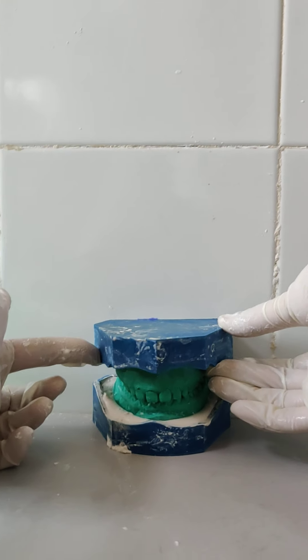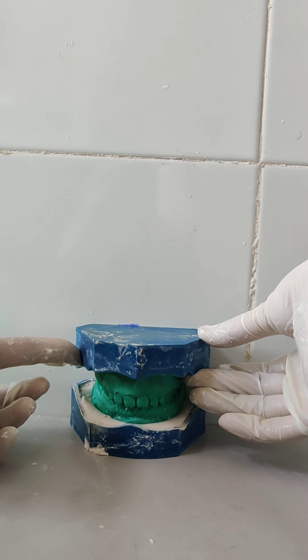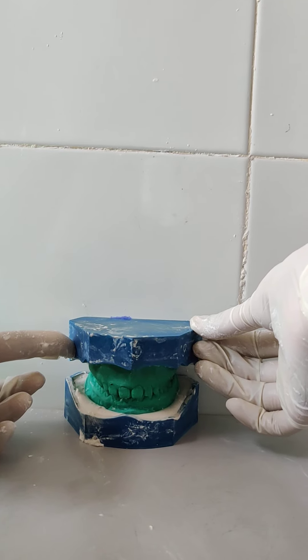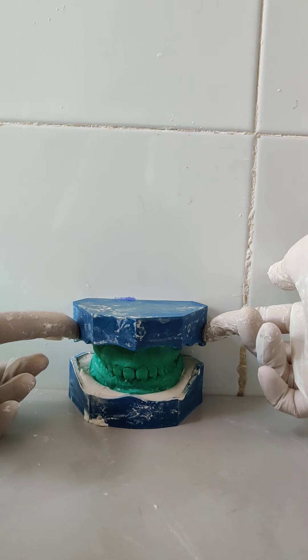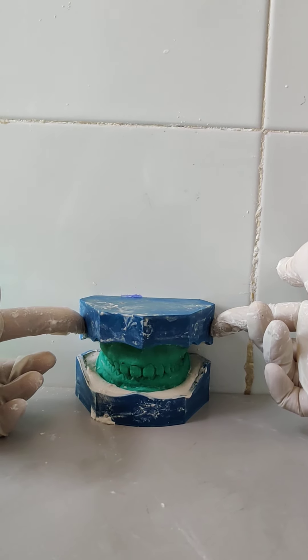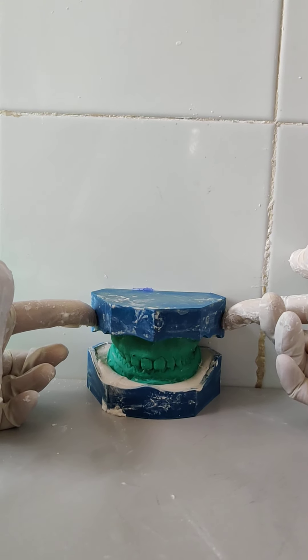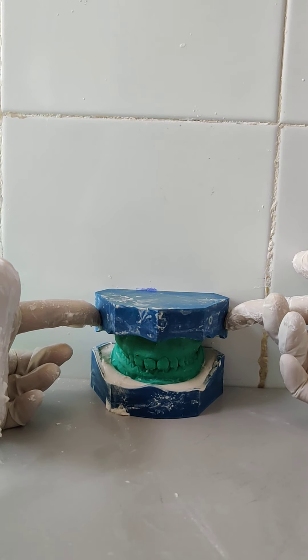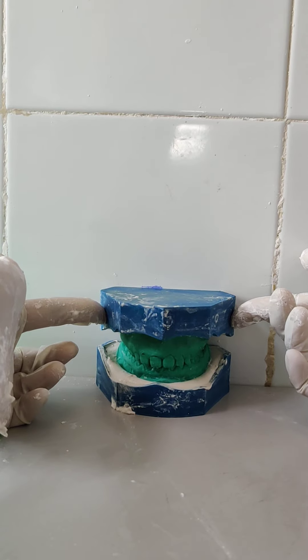We need to make sure that the occlusal plane is flat and parallel to the floor. You can check it with the help of a metallic scale. When the plaster is not fully set, make sure you don't press it too hard, otherwise the 7 mm height will not be matched.